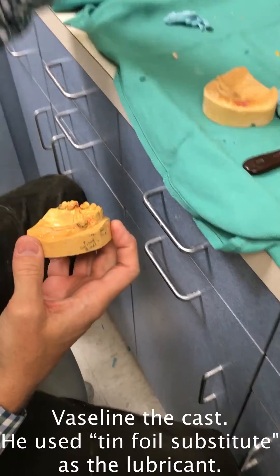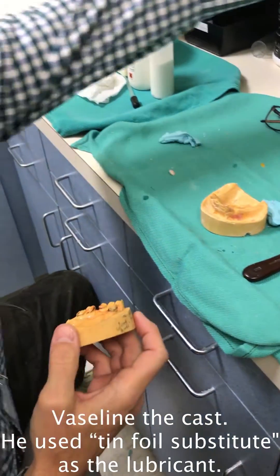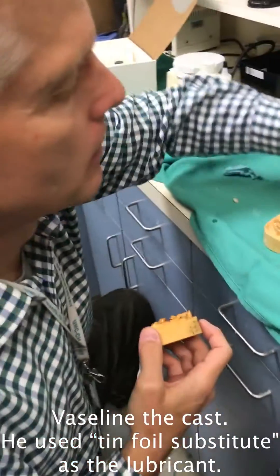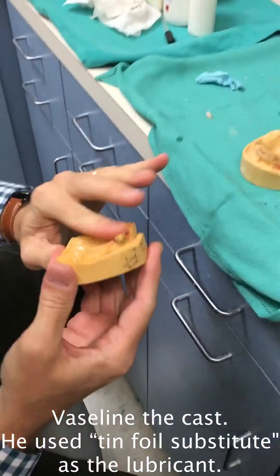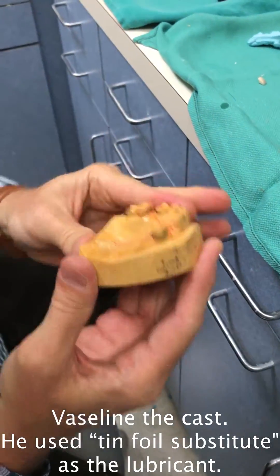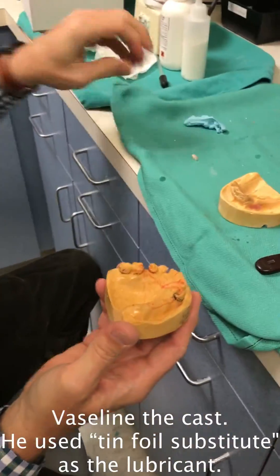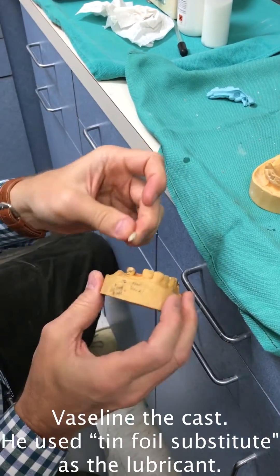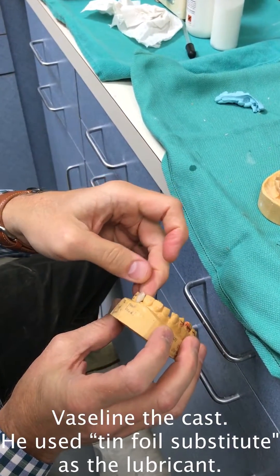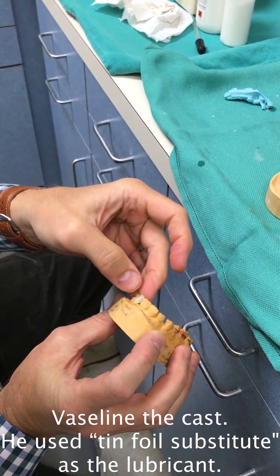I'm going to use a little tin foil substitute. Sometimes I'll run a little Vaseline too, just a little bit, right after the substitute dries. I'll run a little Vaseline on it. When you're dealing with the separating media and the Vaseline, you want to keep your tooth surface clean because you're going to be bonding to that, so you don't want to contaminate the tooth surface.